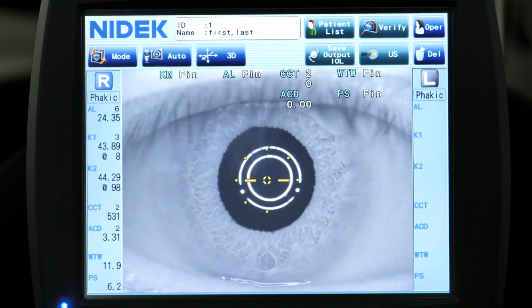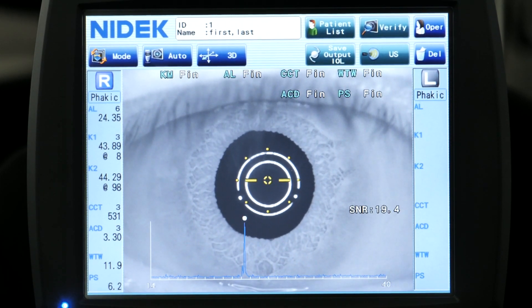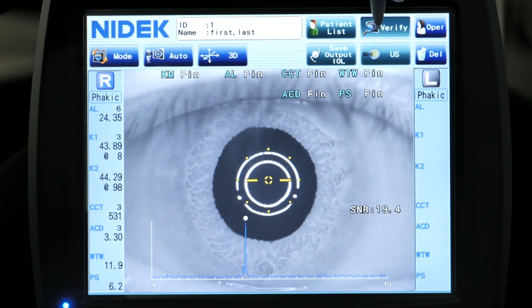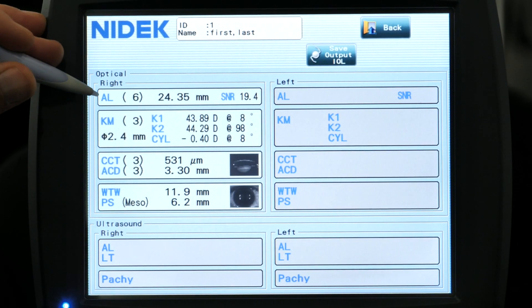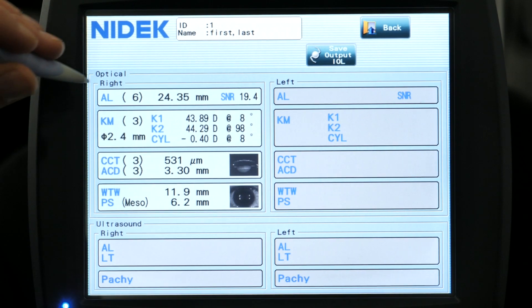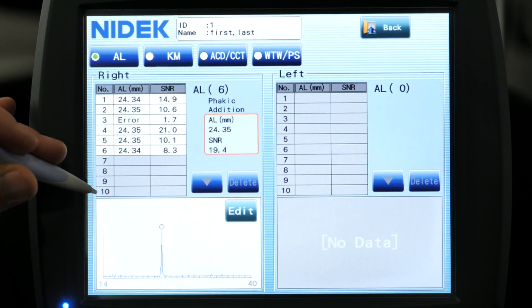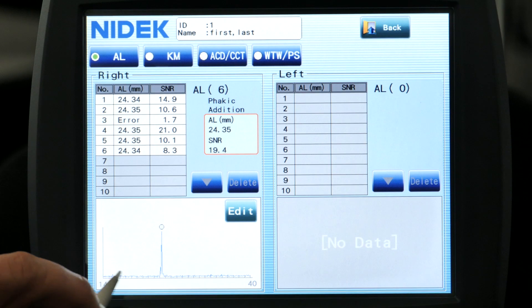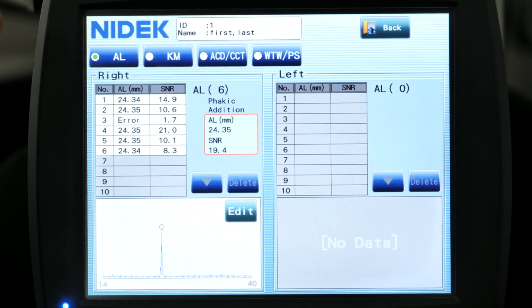And as you can see, the exam is already completed — that's how easy it is to use. At this point you can just verify your measurements if you want. So you can select axial length here, and it's going to show you your axial length measurements. It's going to select the one that's got the higher signal-to-noise ratio for you already.